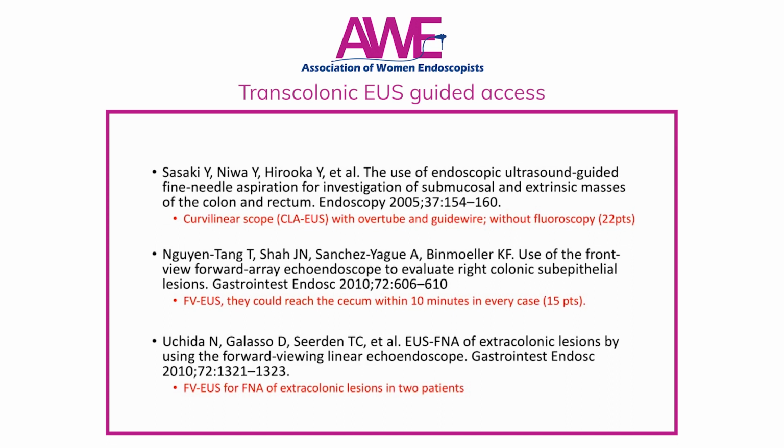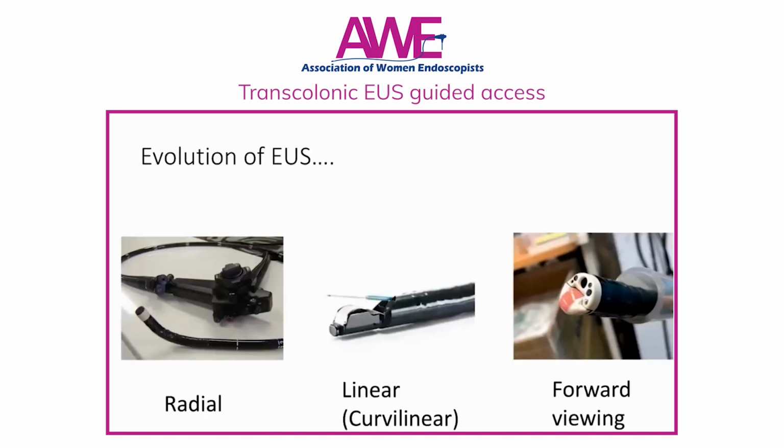In the same year, in 2010, Uchida also published the ability to evaluate extracolonic lesions and perform EUS-FNA with the forward-viewing echo endoscope.